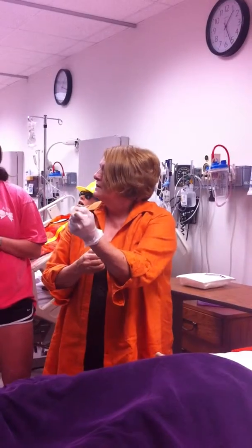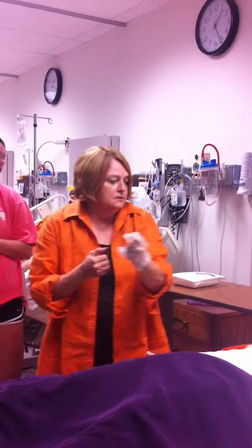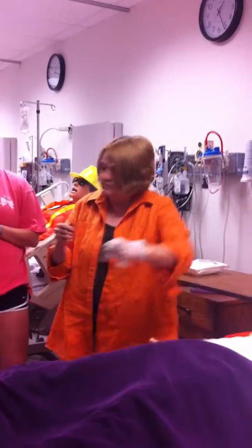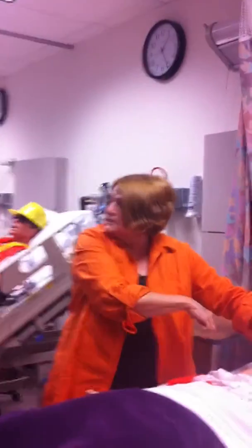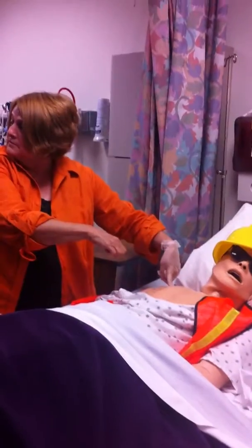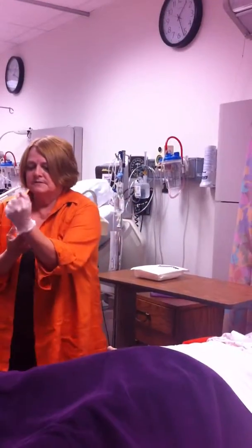When you say keep the hub under control, you can't touch it though? You can, when you're taking the dressing off, I touch it as I'm pulling the dressing off, and then yeah, you can touch it. You're gonna clean the whole thing and get it all clean, right? Yeah. Without sterile gloves. Okay. Now don't have on sterile gloves yet.